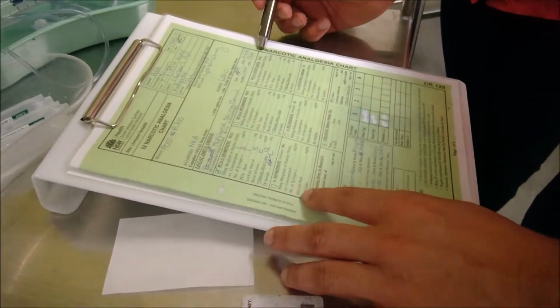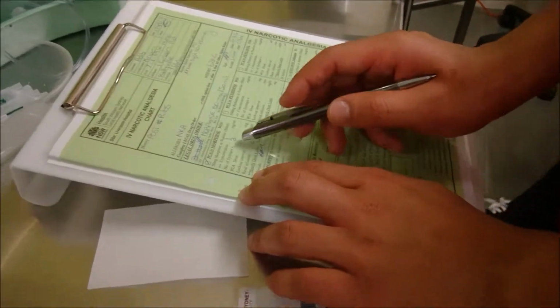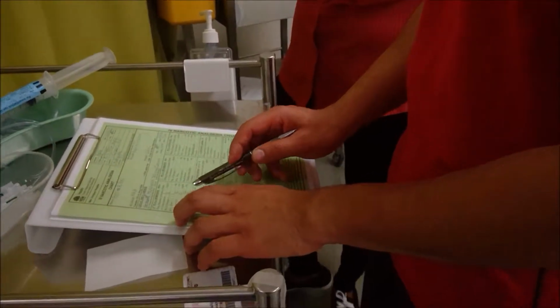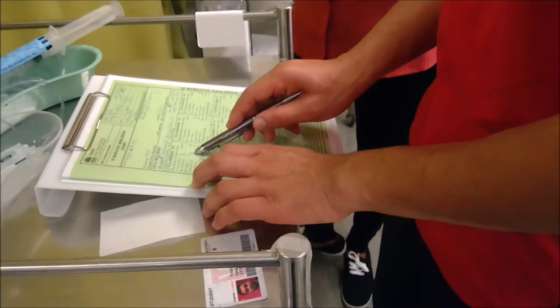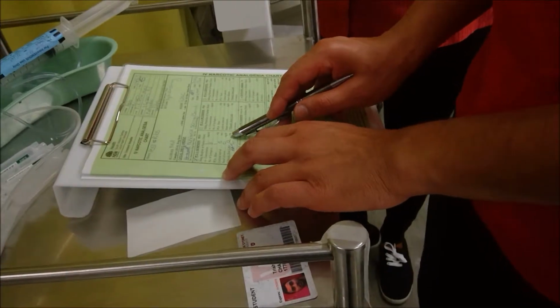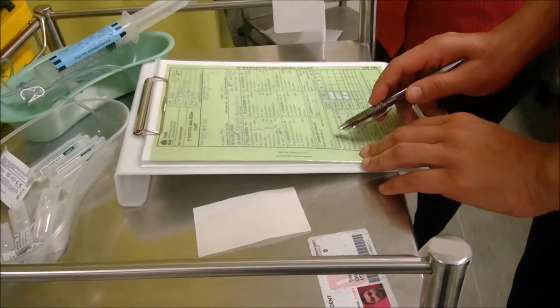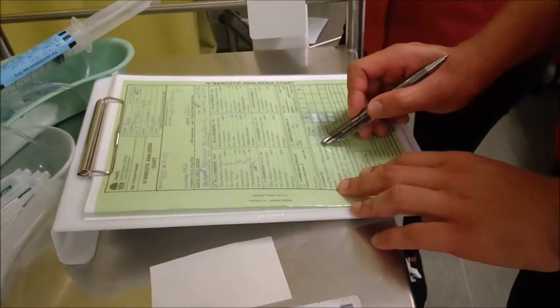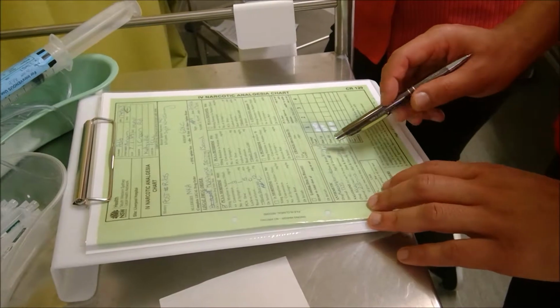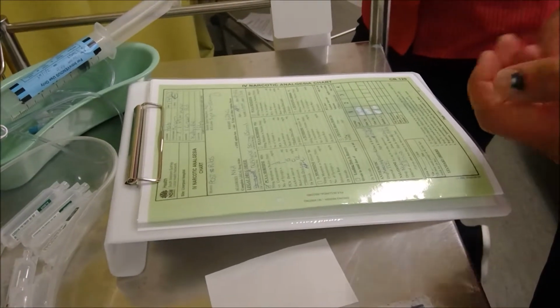It's an IV narcotic analgesia chart. So, it's a PCA order for morphine. The concentration is 1 milligram in 1 mil. The number of syringes we'll be using is 3. PCA dose is 1 milligram. Lockout interval is 5 minutes. Basal infusion is 0 milligrams an hour. The hourly dose limit is 12 milligrams, and it has the doctor's initials. It hasn't been given yet. We also have antiemetics, Maxolon 10 milligrams through IV, and naloxone 0.2 milligrams through IV. That's for nausea, vomiting, and just a general reversal if the patient is feeling unwell and requests it.